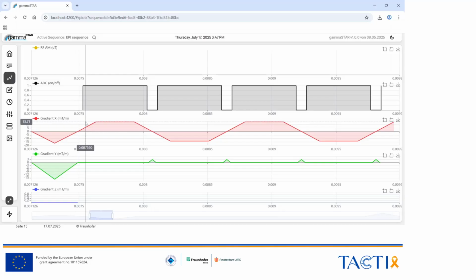Let's just consider we are acquiring a single line in k-space. If we start sampling or reading out the data with a specific sample rate, what's happening is that with a constant velocity we travel through k-space, and with a constant rate of sampling frequency we acquire our k-space samples. So that would mean that with a constant velocity and sampling rate we get equidistant samples of our k-space.